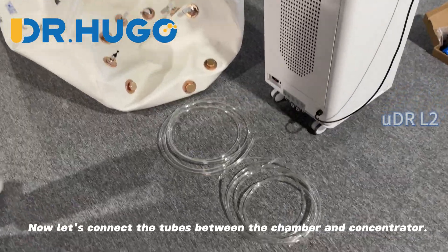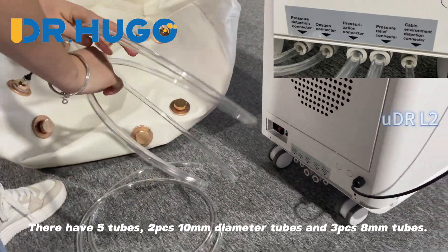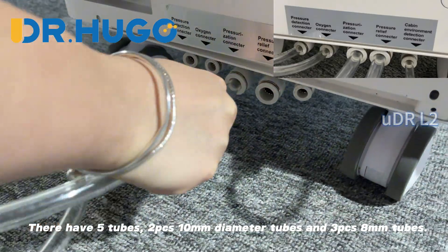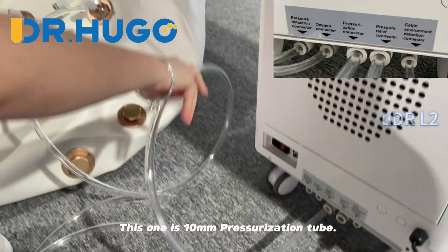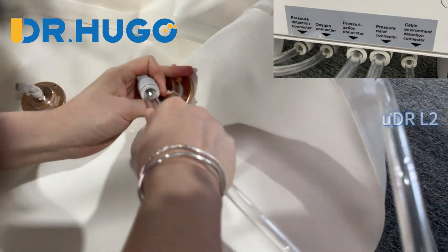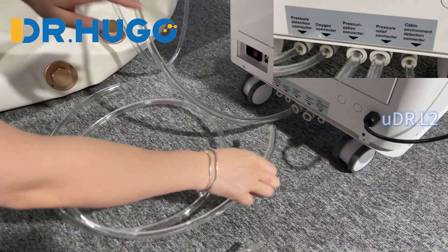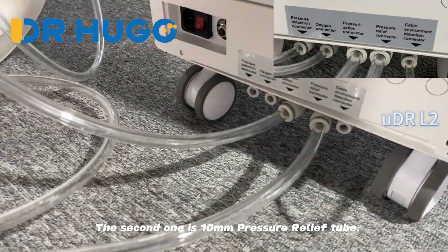Now let's connect the tubes between the chamber and the concentrator. There are 5 tubes in total: 2 pieces of 10mm diameter tubes and 3 pieces of 8mm tubes. This one is the 10mm pressurization tube. The second one is the 10mm pressure relief tube.